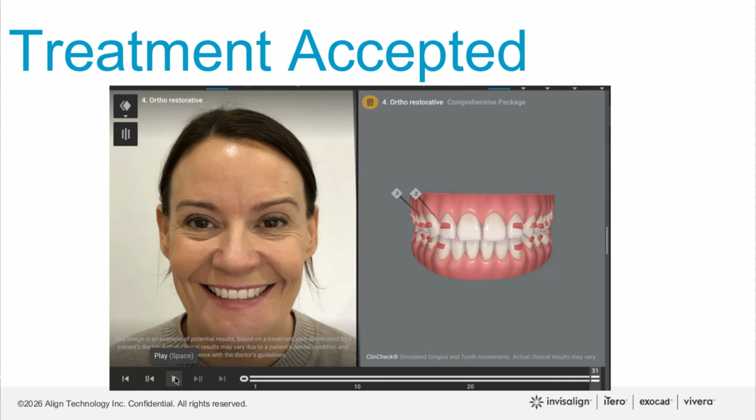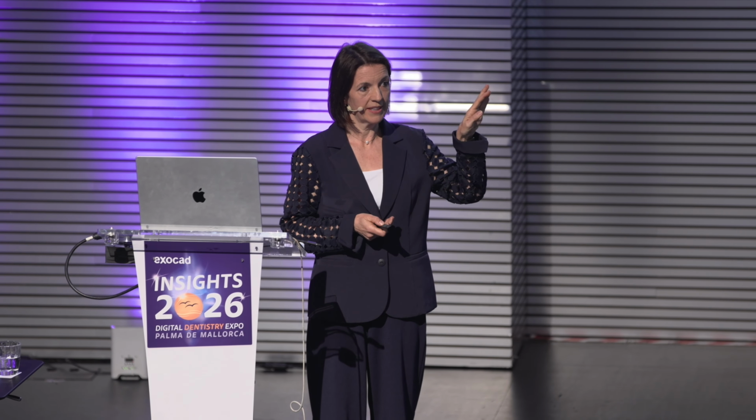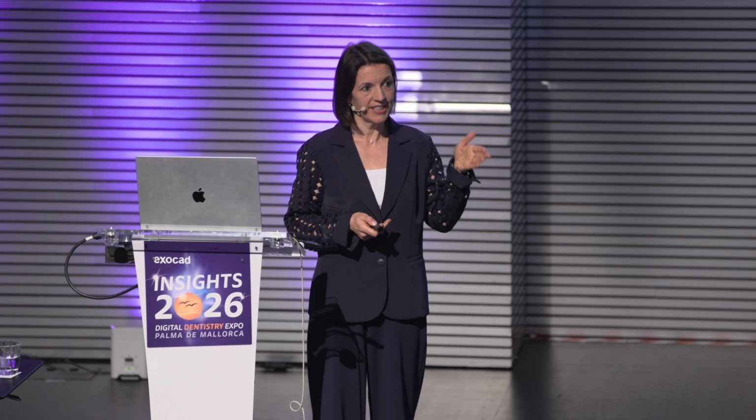So you notice what she wasn't talking about until the very end, she's like, I need 5 to 5 done. Like, I'm not going to be happy with just the anterior teeth. But she was so emotionally overwhelmed with the improvement that that's going to make to her, that then it's no question. So then I could say to her, are you going to do the 31 aligners of Invisalign? Because if any of you treat staff members, you'll know they can be the worst at compliance. They'll give up halfway through treatment. But now she has in her head that because we've designed it on Smile Architect and she understands it's tooth movement and restoration, she's going to dig in, and she's now got her attachments on and she's into treatment.